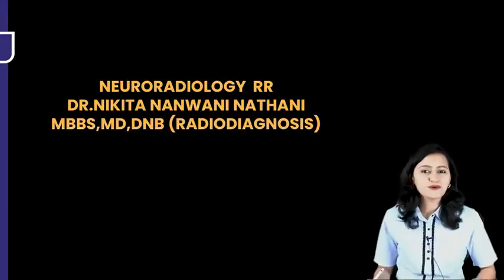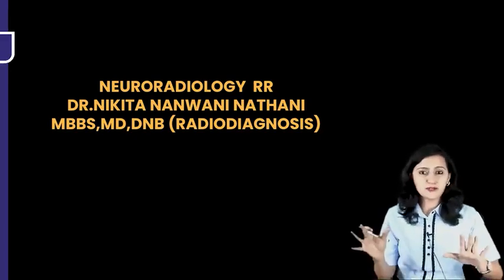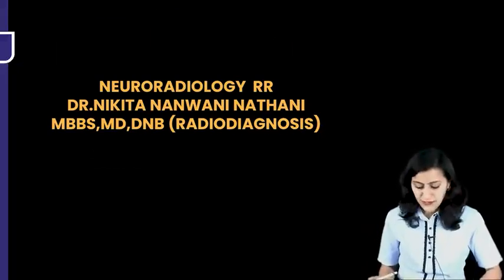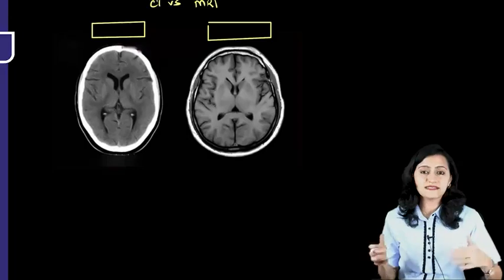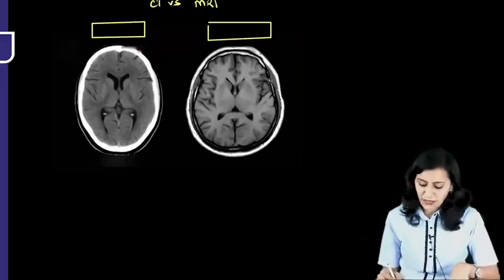Hello friends, so now we are going to do a rapid revision of neuroradiology, a very important system overall as well as from the radiology perspective. The first thing we are going to see is the various modalities and where we use which investigation. So how do we differentiate CT from MRI?